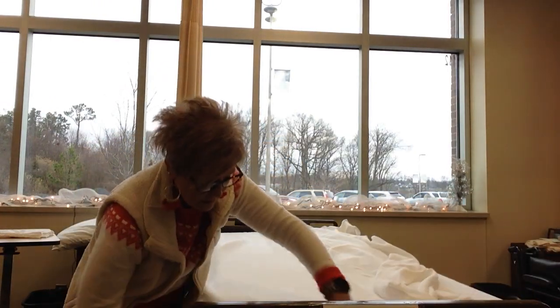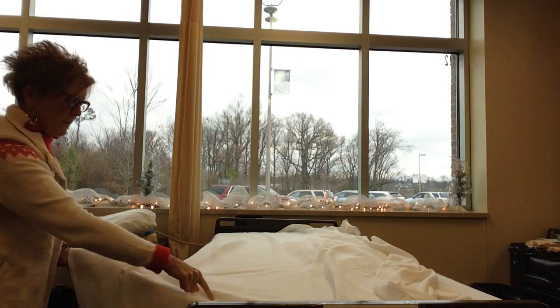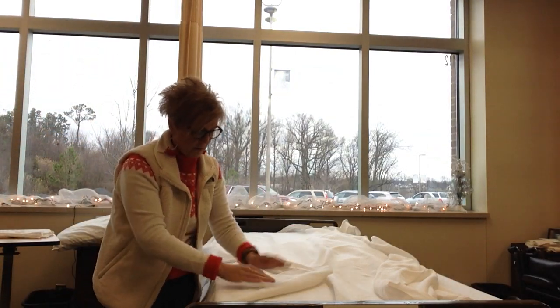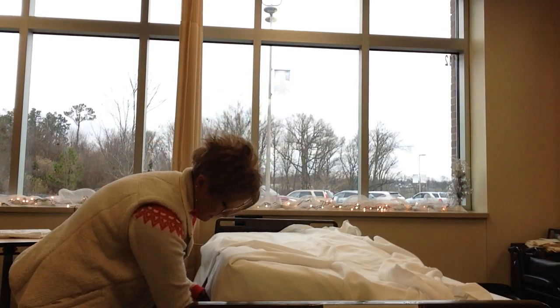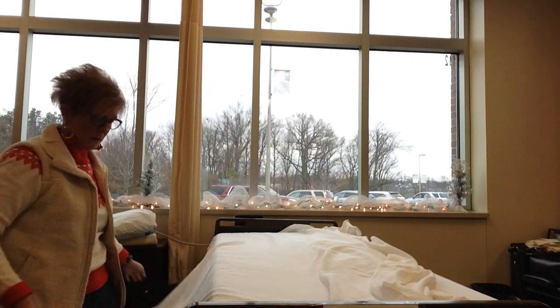Then I'm going to make what we call a mitered corner. I'm going to pull out the sheet and the bedspread. I'm going to come up about a ruler's length, lay it up on the bed and make what looks like a triangle. Then I'm going to tuck in the blanket and the top sheet.